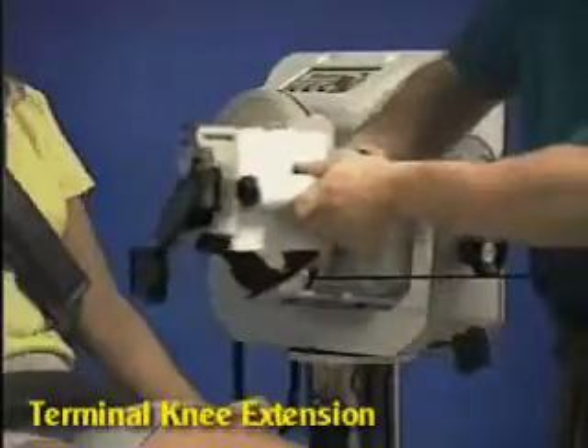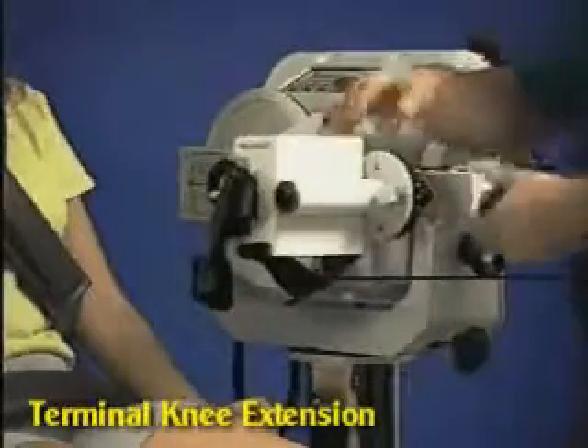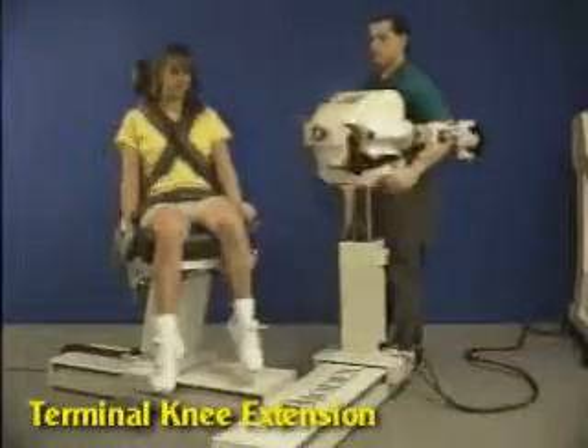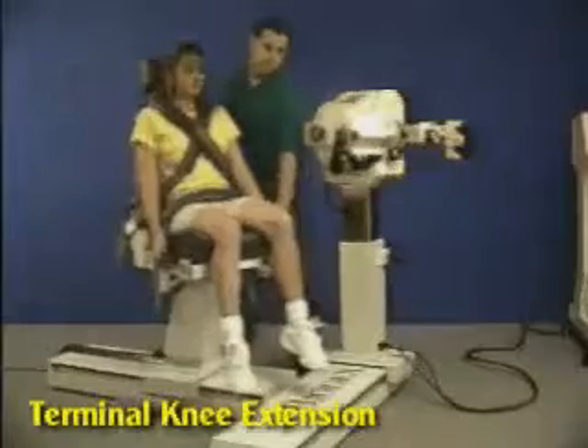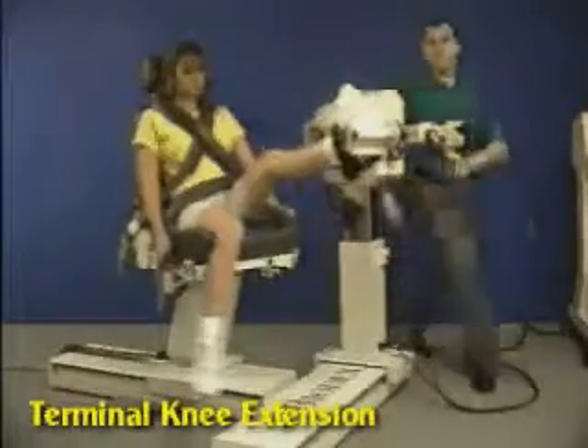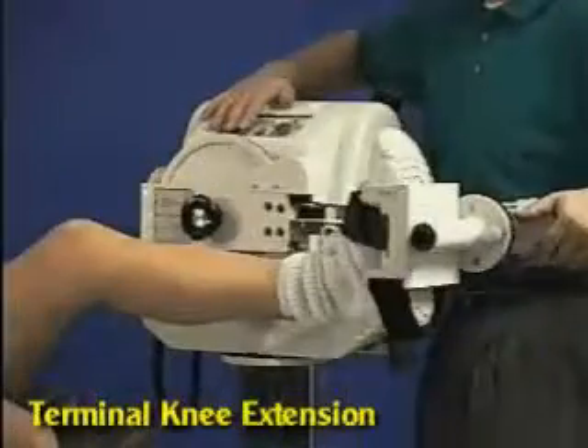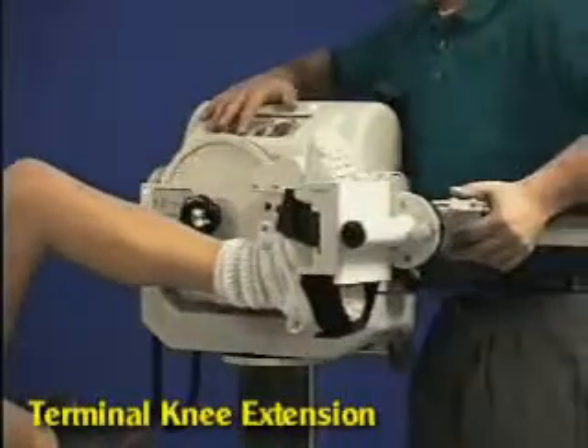Install footplate to closed chain attachment. Move chair back and rotate dynamometer to align with the patient's leg, then move patient into position. Place patient's foot into footplate and secure it, then set range of motion stops.